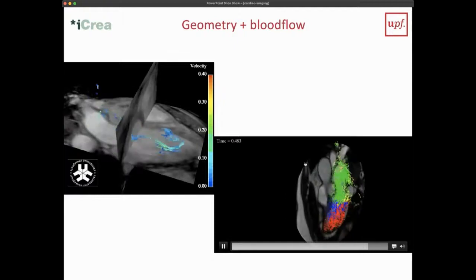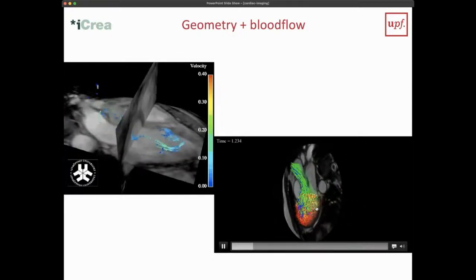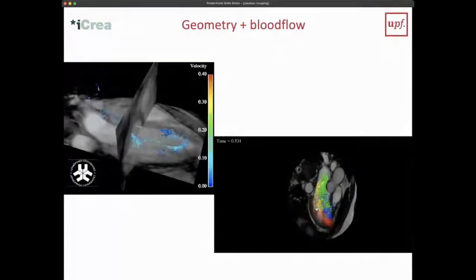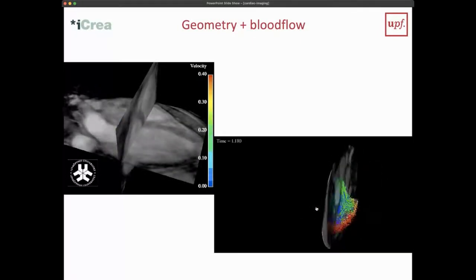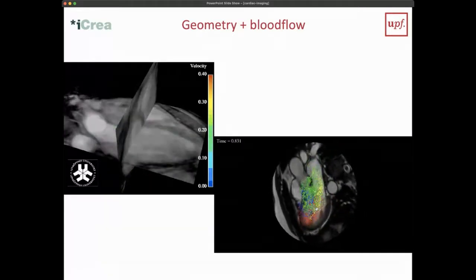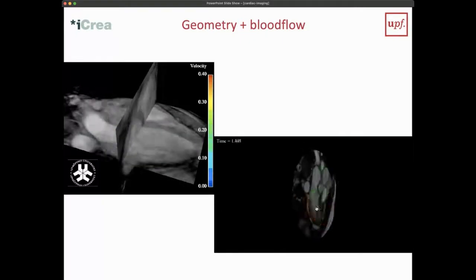And you could even measure, this is like a colorization of how long a blood particle stays within the heart, whether it is already ejected in the same heartbeat or 2 or 3 heartbeats later, which is particularly important because in some of these very dilated hearts, if blood stays too long without moving, it can start clotting. And so this way you can really analyze these things.